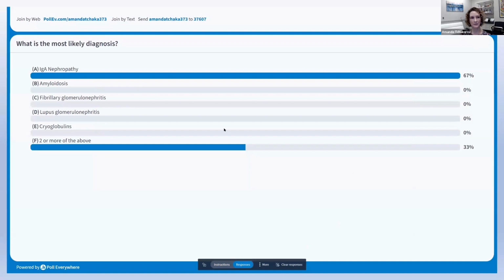Looking over at the responses, based off of what we've seen so far, IgA nephropathy does seem like the most likely diagnosis. However, there is also the option that there may be more than one of the above here, particularly given the topic of the lecture.